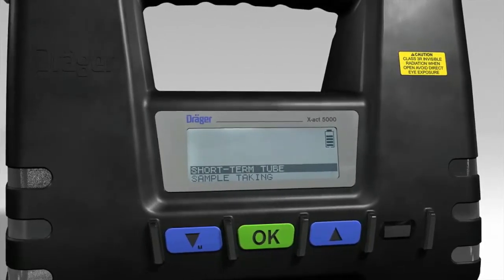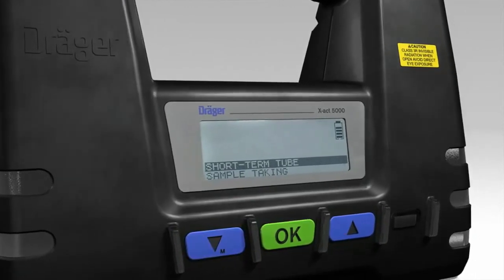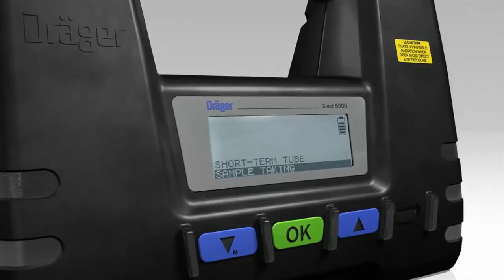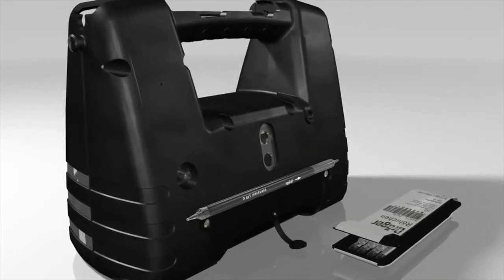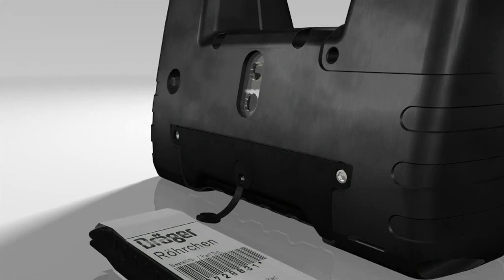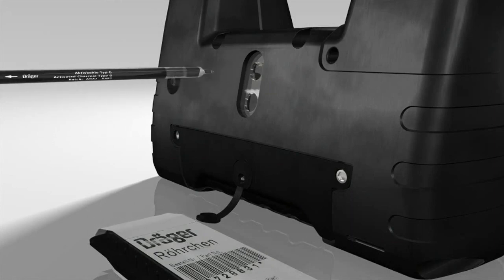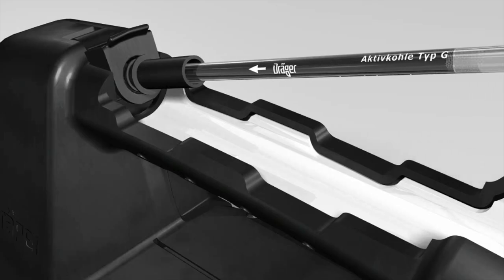Choose between the individual measuring functions shown on the display. Use the arrow buttons to select sample taking and press the OK button. Take a sampling tube out of the box and open it on both sides by using the integrated opener at the back of the tube pump. Place the sampling tube in the tube holder. The arrow on the tube points to the pump.